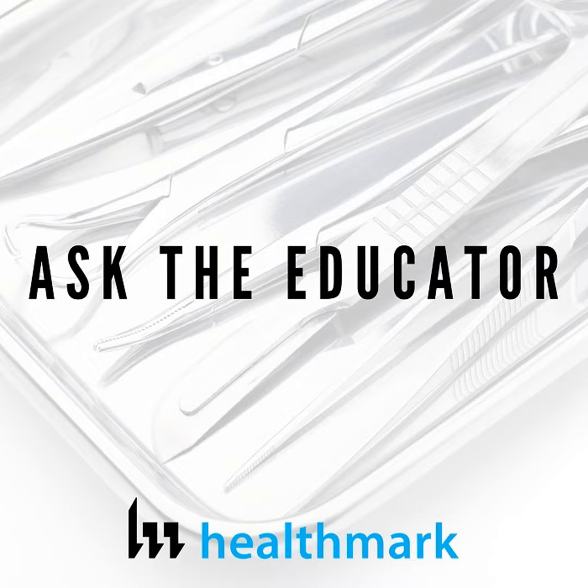First of all, make sure you're at the meetings for purchasing new devices so that you know what devices are coming in. You can review those IFUs and then connect to the staff and make sure that they know, hey, this new device is coming in. Here's how we clean it. And then also, I think it's really important to have the right tools.